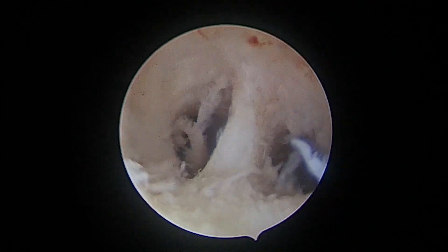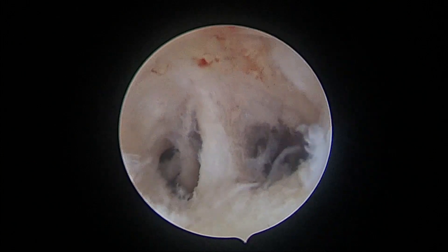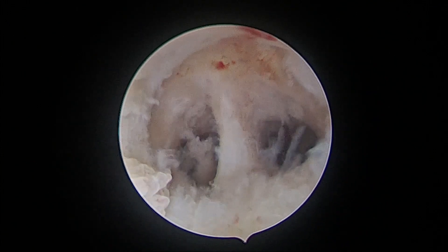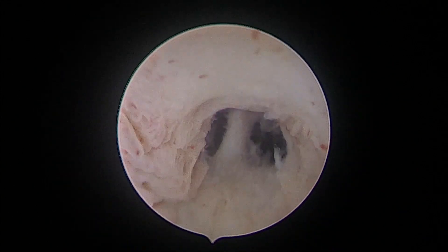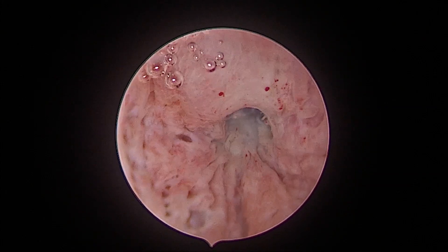The most interesting part is the identification of the septum from the internal os. This is the owl's eye appearance — it looks like the eyes of an owl, and both the uterine cavity and the tip of the apex of the septum are seen. This is the cervical canal, and then we exit.